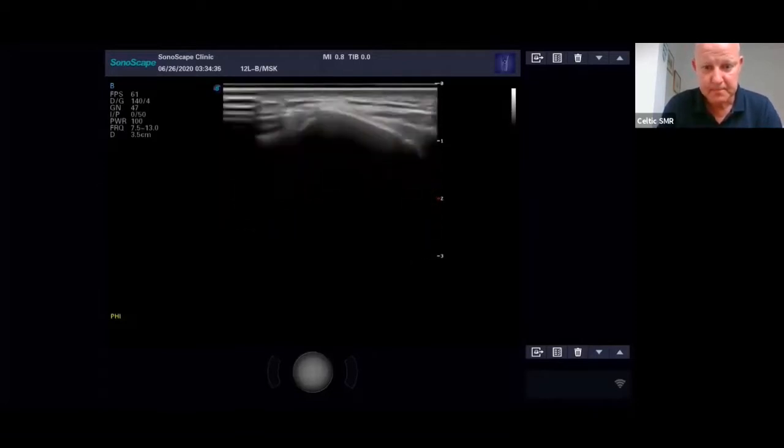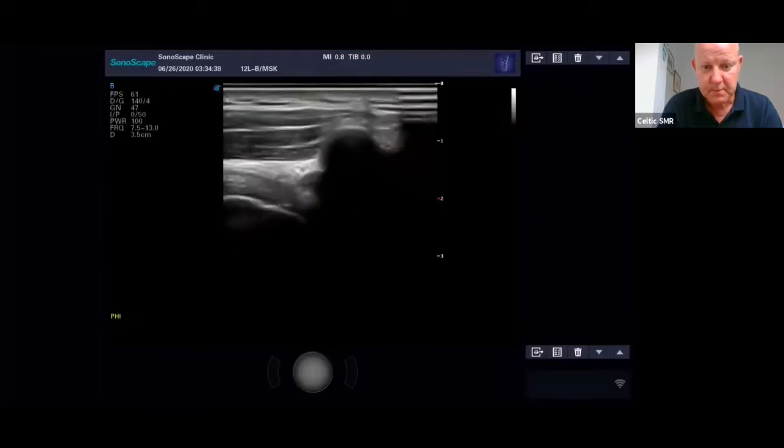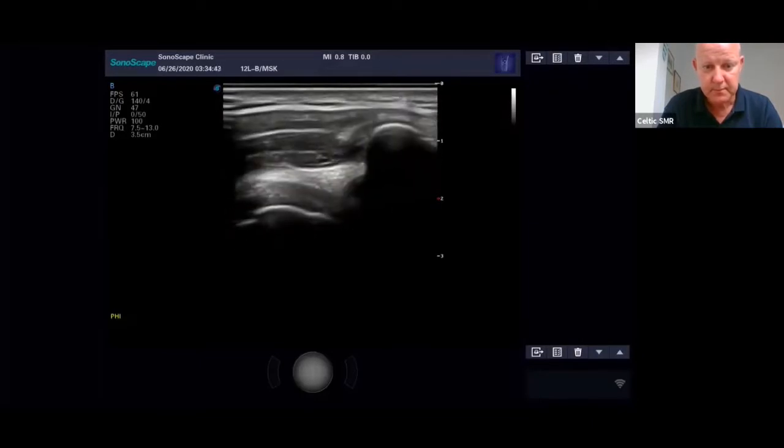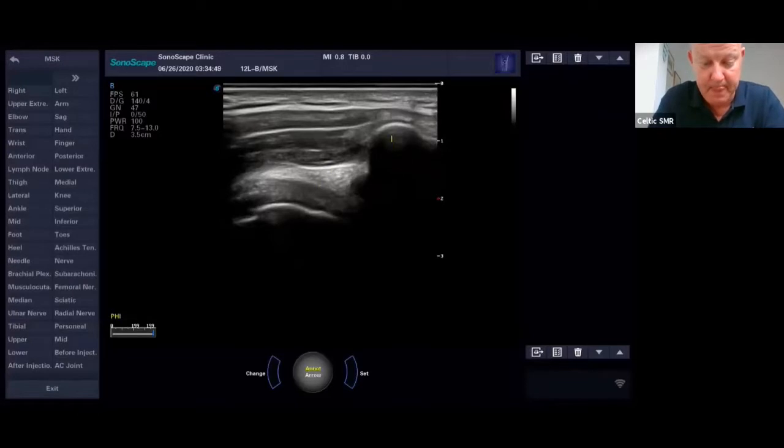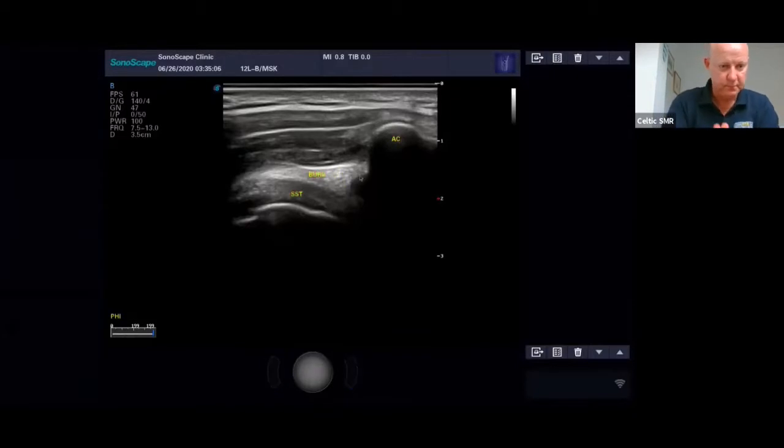What I tend to do is find the acromion here, and then just off the acromion you'll see, let me just annotate this for you. So that's the acromion process. This is the supraspinatus. This is the bursa, and we're looking through here. So this bursa has got to fit underneath here. So this is all bone. And don't forget, this bone carries on. This is just what I'm seeing with my ultrasound, but the bone actually probably carries on to here and then carries on under there. So this space is very, very narrow, especially when you've got a thickened bursa, and that's the tendon.